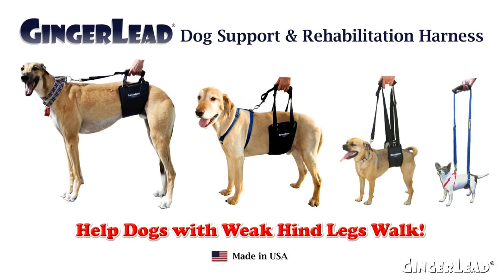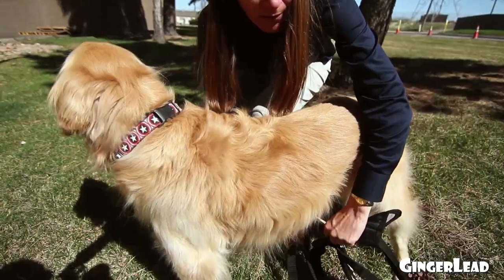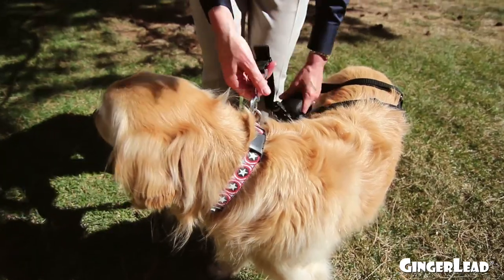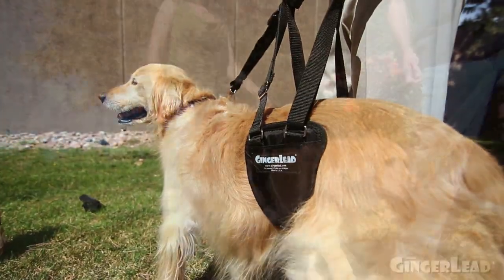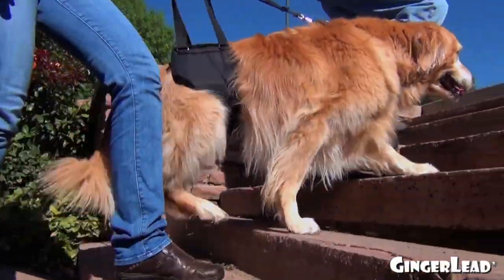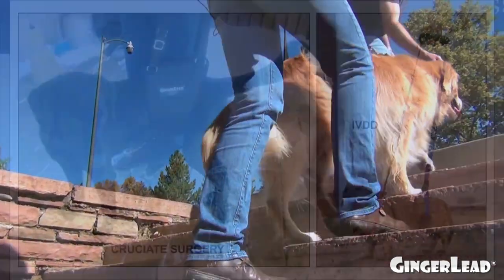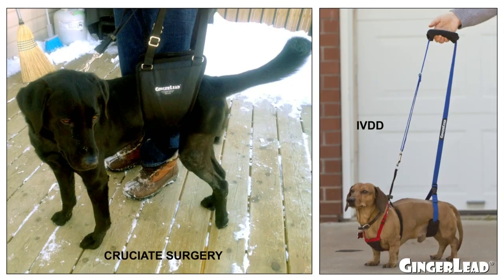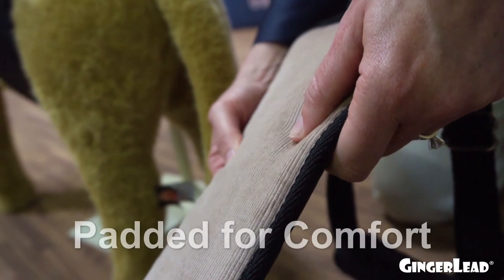Hi, I'm Liz, co-founder of Ginger Lead dog support and rehabilitation harnesses. We've been helping dogs with limited mobility since 2008, including older dogs that could use some help going up and down the stairs and out for a walk, and also dogs recovering from orthopedic injury or surgery.